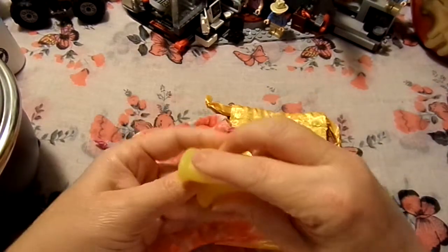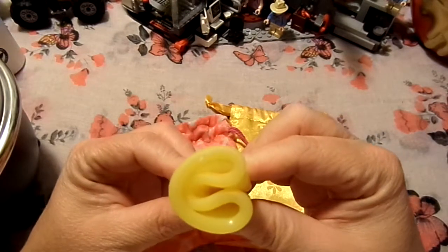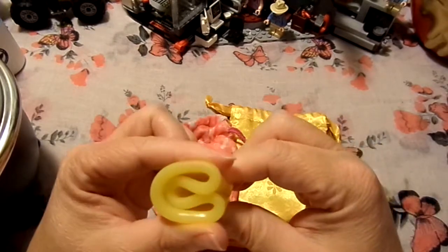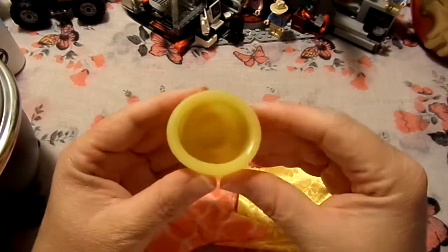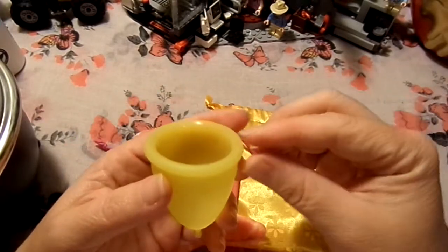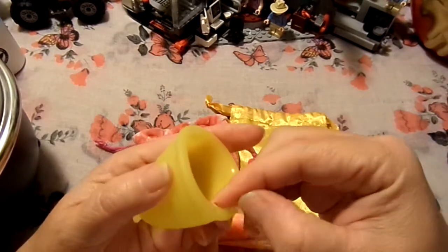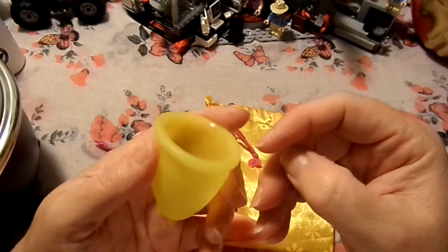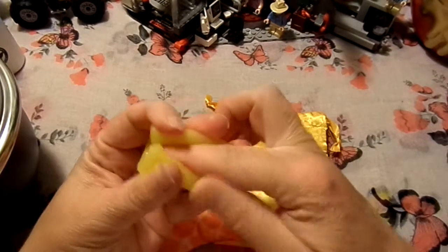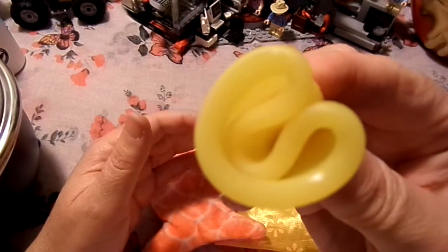There is also the C cup fold. When I started using the Diva cup with this C fold, I didn't like it. It was still really, really big. This entry point felt really big, and I was uncomfortable with it, and it was just uncomfortable to put in, and with such a wide, like it really isn't that small doing a C cup fold.